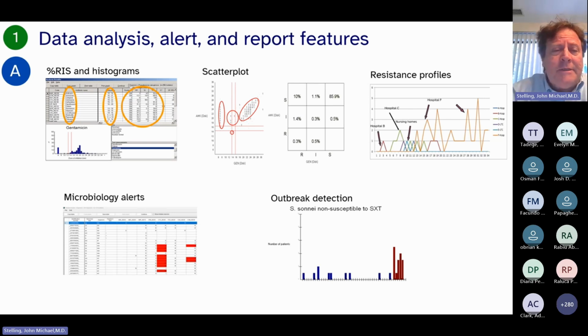I have seen laboratories test E. coli with vancomycin. That's an obvious mistake. It is resistant. There's no need to test it. It's just a waste of resources. That's an obvious mistake. There are other mistakes that are not very obvious. For example, the CLSI has clinical breakpoints for ampicillin and E. coli, but CLSI does not have breakpoints for amoxicillin. So I do see many laboratories test the amoxicillin disc, but CLSI has no guidelines and no breakpoints. It's a mistake, but it's not an obvious mistake.